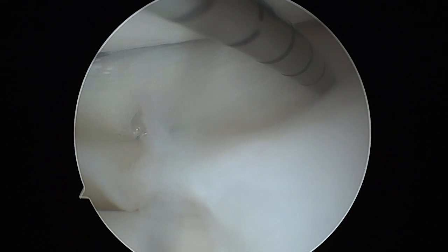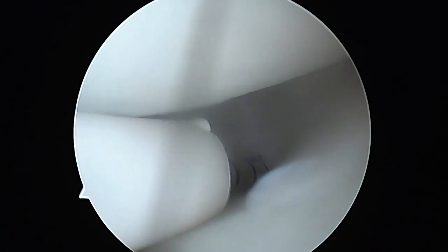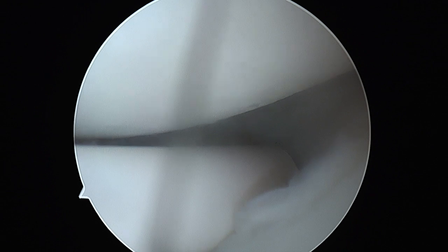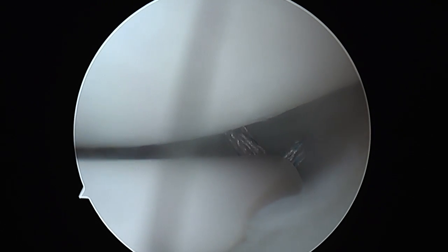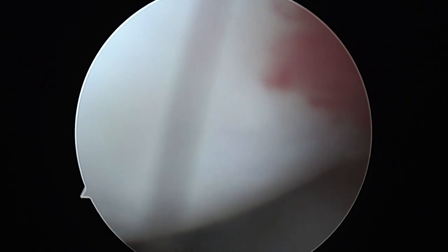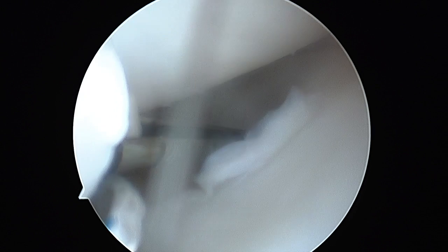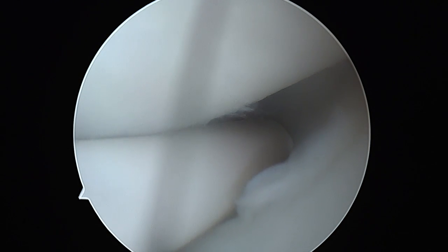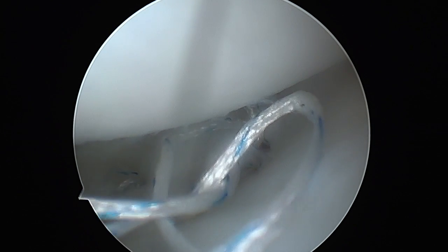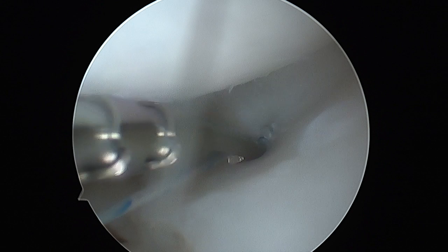The next anchor is then applied more towards the body, as this tear extended from the mid portion of the body of the meniscus to the posterior horn near the root. The device is introduced in the same way and a vertical mattress suture again applied.